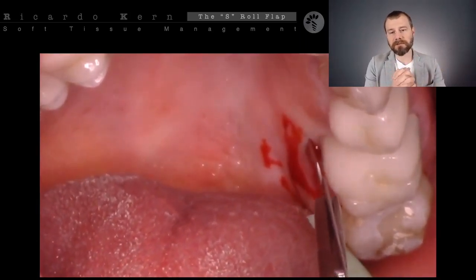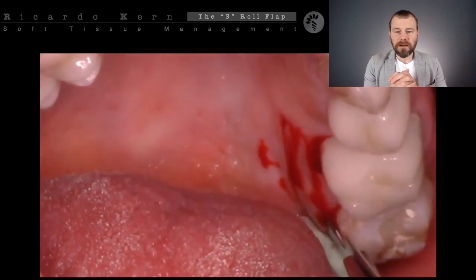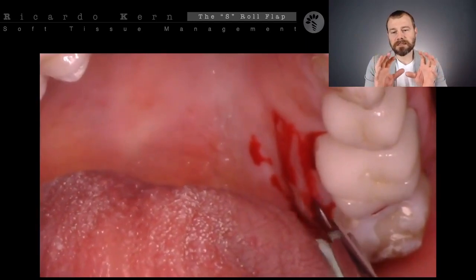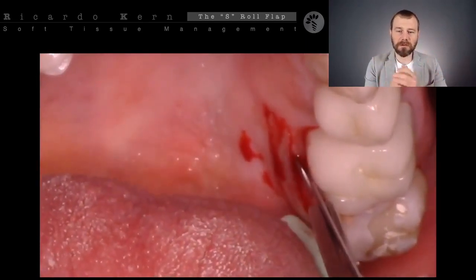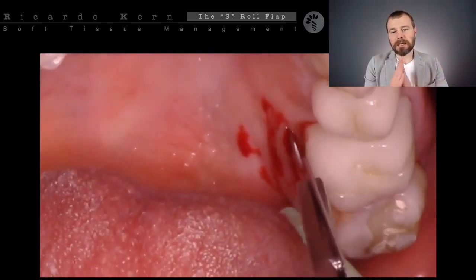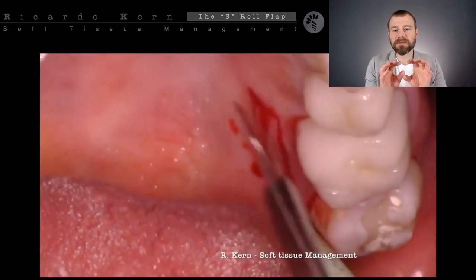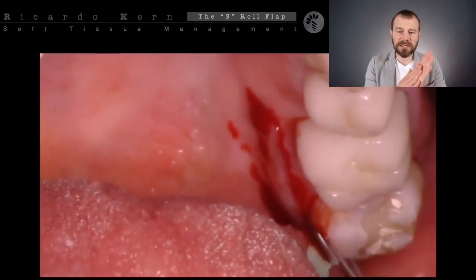of this graft. The farther away you move to collect this graft, I think you have a small improvement on the quality and the collagen percentage of this area, close to the second molar. And I do not have the rugae of the canine and sometimes the premolar present here, so it's easier for me to make the deepithelialization.